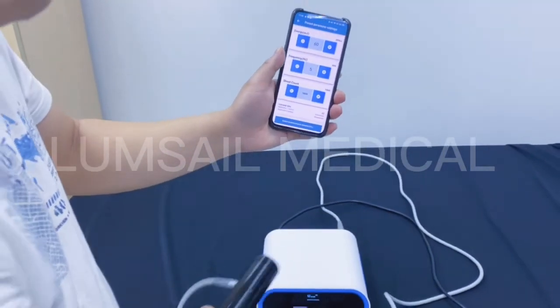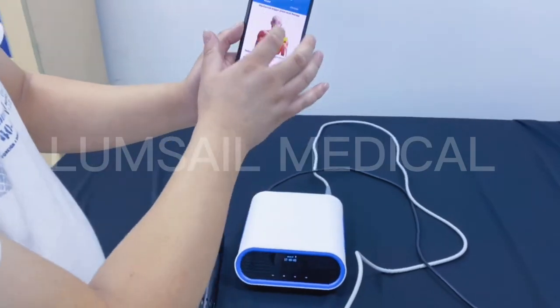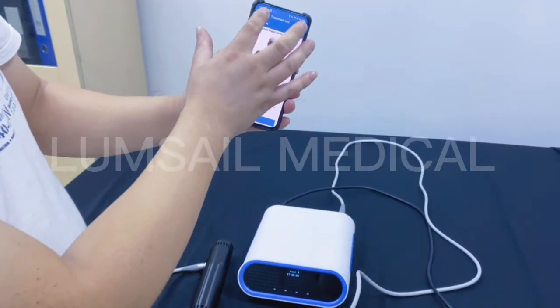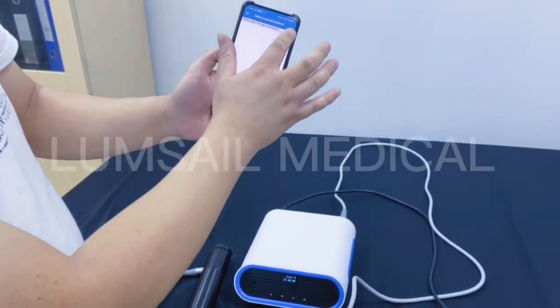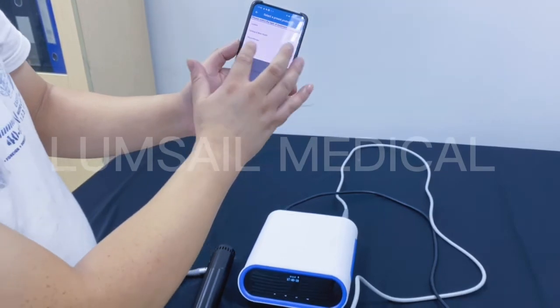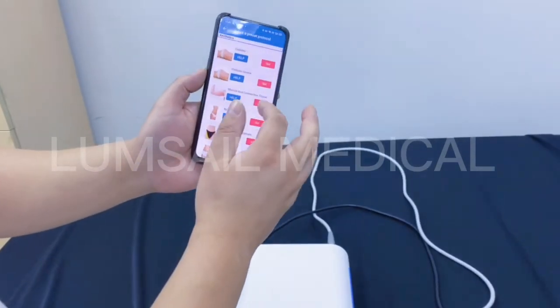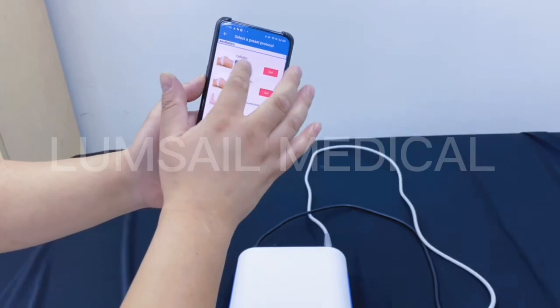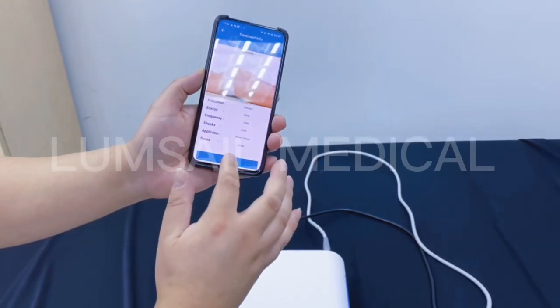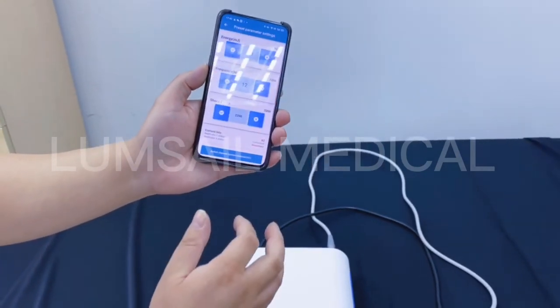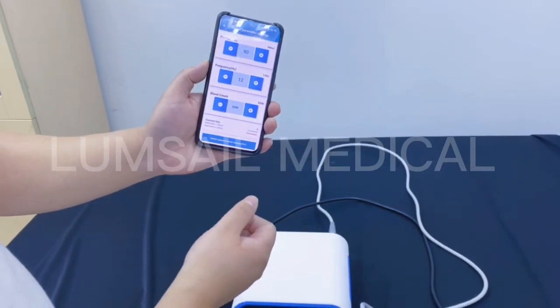We can also quit and select different indications — for example, for aesthetics it can be used to treat cellulite. The parameters are different for this protocol.